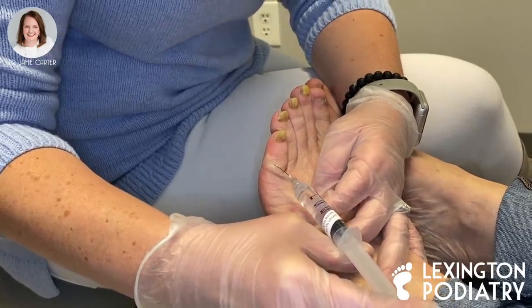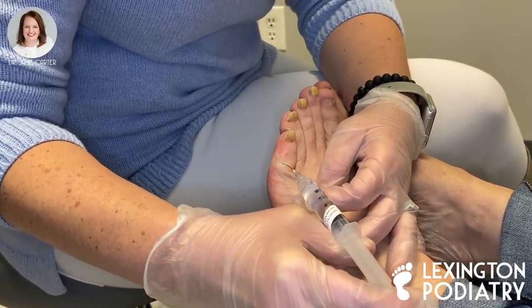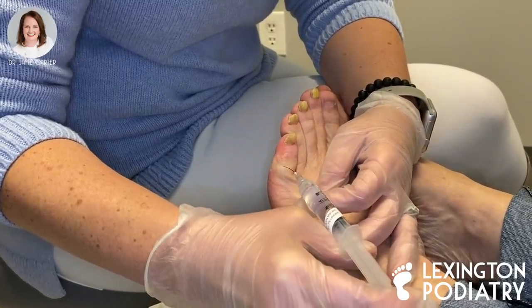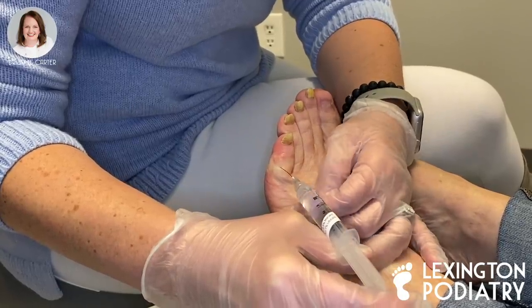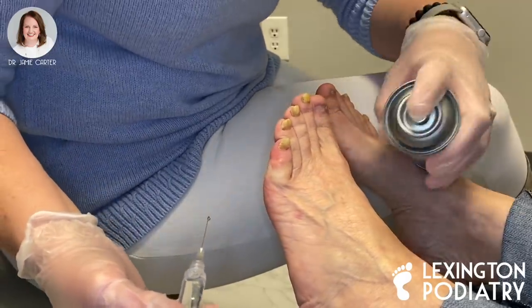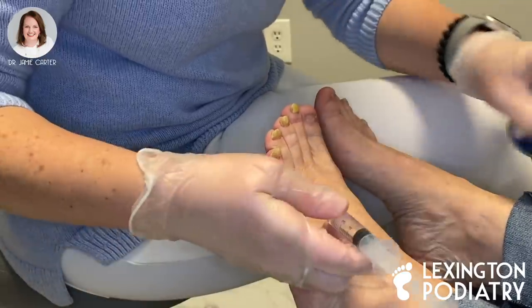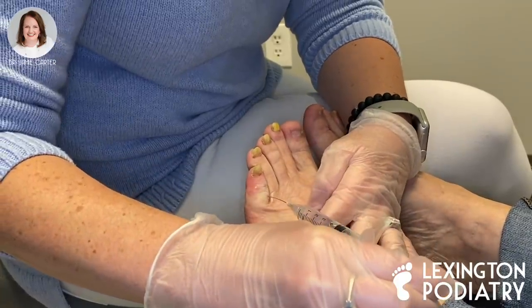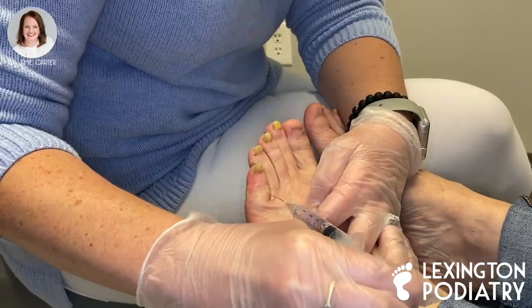It does burn for a second, my dear — you let me know, okay? It's going to turn some funny little colors and that's all part of it. Injecting fluid around the bottom of your toe will kind of block off the blood supply and it makes it look funny. One more — you ready? Sorry, I know that stuff is so cold. Some people choose to not even let me use it, but not very many.